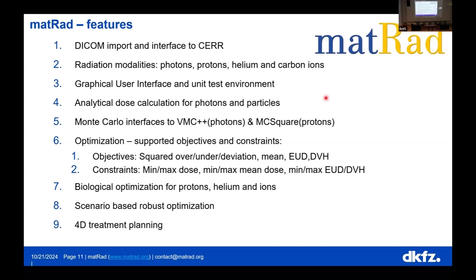And that's the primary thing for research with matRad, that you can do weird stuff that a regulated treatment planning system will never implement and the vendor will never implement because it's not yet commercially viable. Nobody has tested it. It hasn't gone through the preclinical phase yet, so they will not implement it.